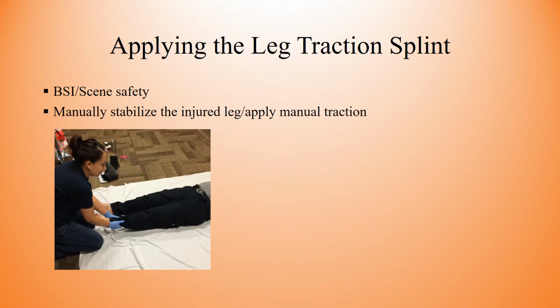So now we will go over applying the leg traction splint. And here are the steps. Of course, on all of our calls, be aware of scene safety, it's paramount. And then you'll manually stabilize the injured leg and apply manual traction.